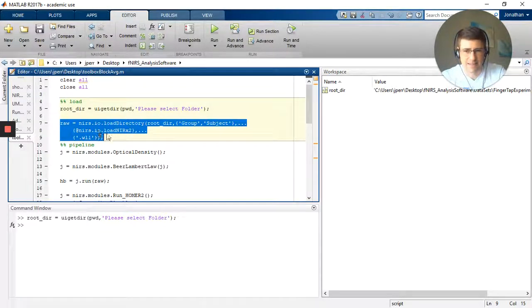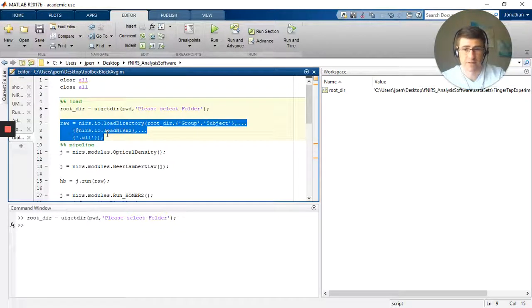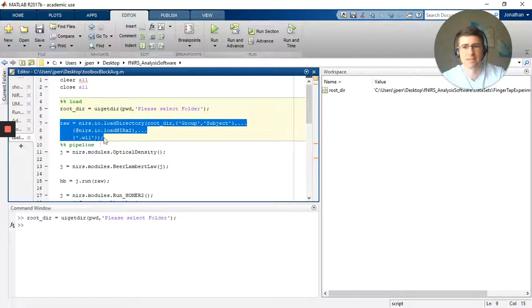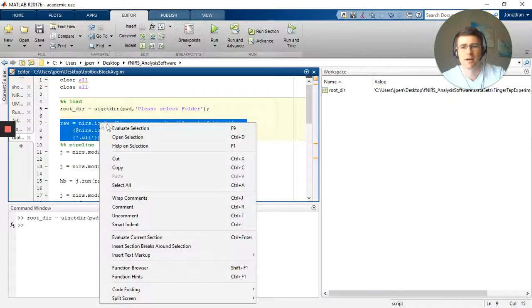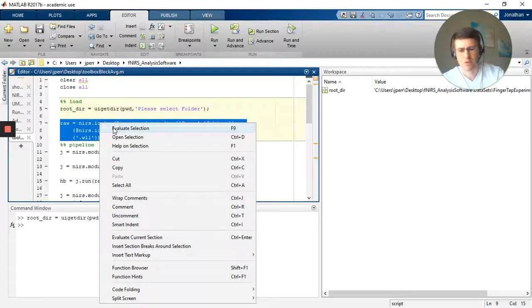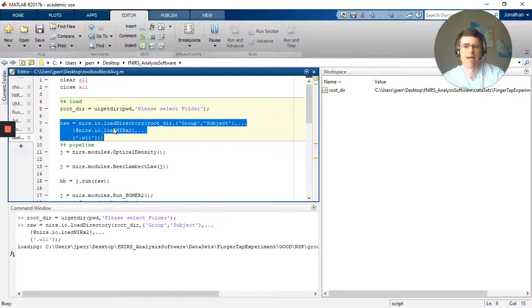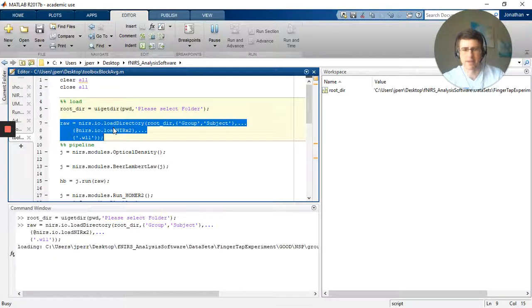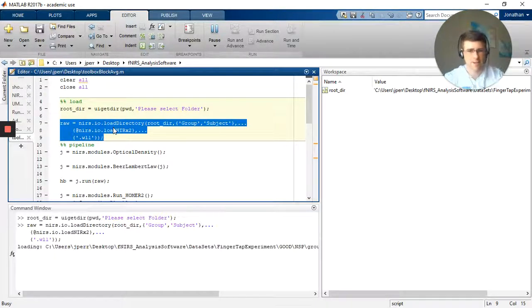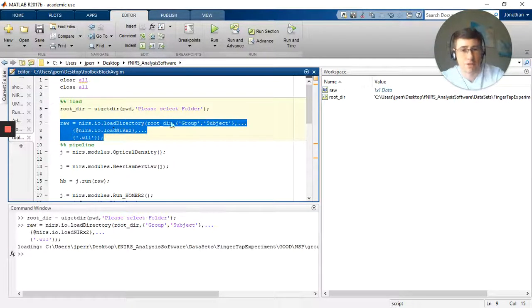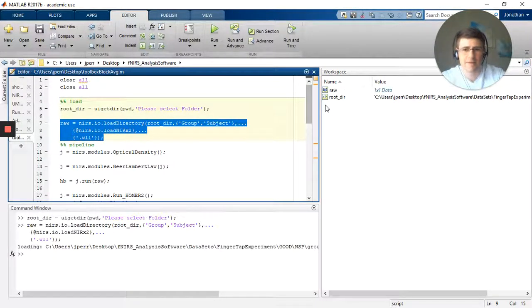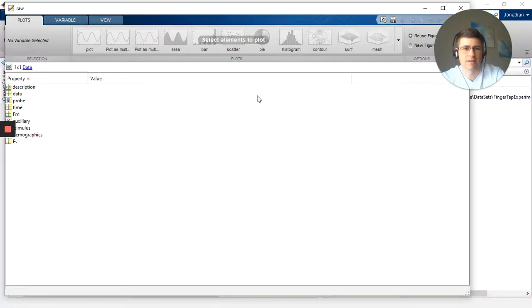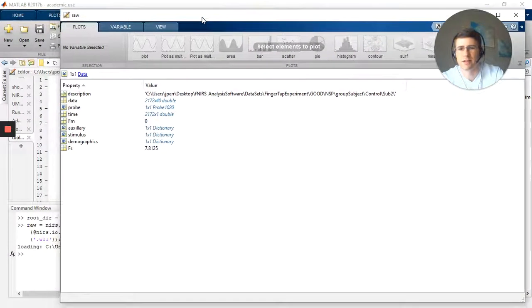I then have to designate which function, which sub-function I'm going to load the data in with. I'm going to use loadNIRx2, and I'm going to look for a wl1 file type or file extension. So I'll go ahead and evaluate. This takes a little bit here. Of course if you have other types of data, not a NIRx data set, you can use other load functions. So here my raw data has been prepared, so I've loaded it in.